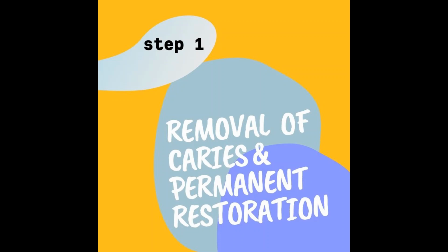Step 1. Removal of caries and permanent restoration. This is essential to mechanically eliminate as many microorganisms as possible from the interior of the tooth, for assessment of tooth restorability and to provide sound tooth structure so that an adequate provisional restoration can be placed.